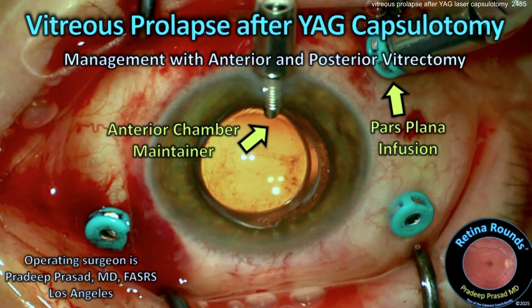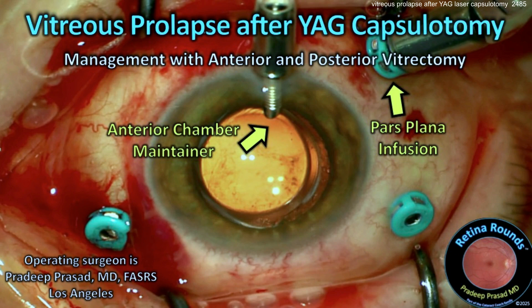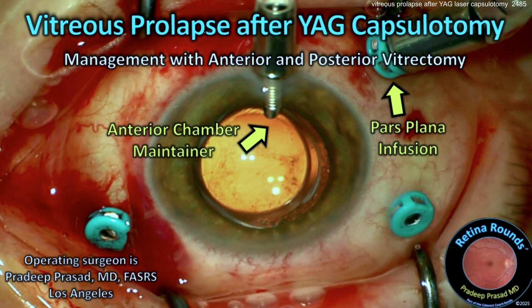Welcome to retinarounds.com. Today we're going to be looking at a case of vitreous prolapse after YAG capsulotomy. This is a pretty rare complication, but when vitreous migrates into the anterior chamber it can put patients at higher risk for cystoid macular edema, retinal tears, and retinal detachments.